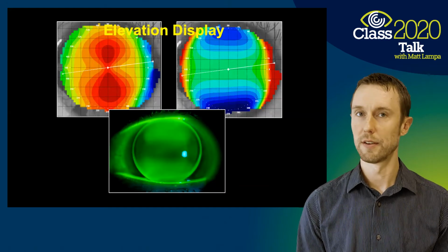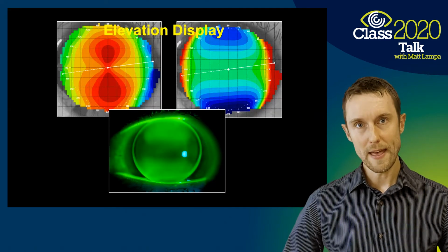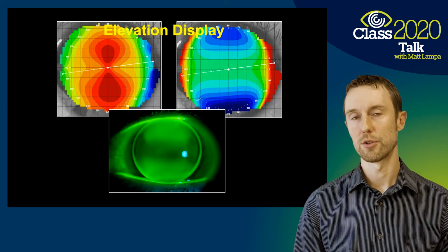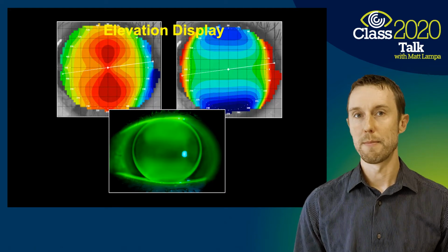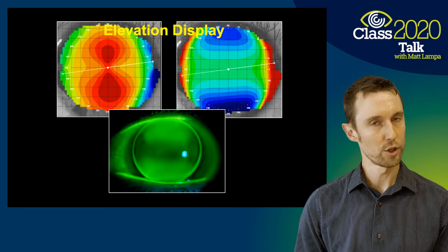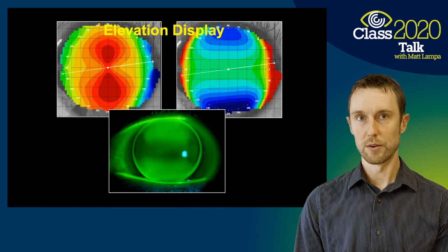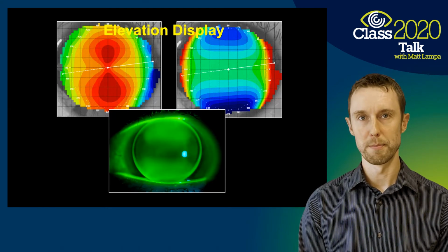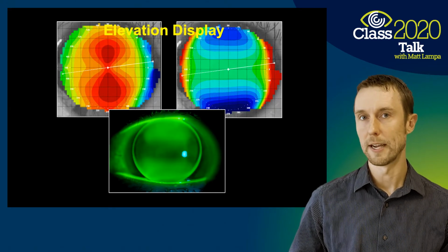The analogy I think of here is just like the topography map of a mountain, where if we lay that topography map out on our table and look at the map, it's giving us 2 very important pieces of information. Where those lines get really close together, means the mountain changes in curvature really fast, it's really steep. Where the lines get further apart on the mountain, it means the mountain's kind of plateauing out, flattening out.